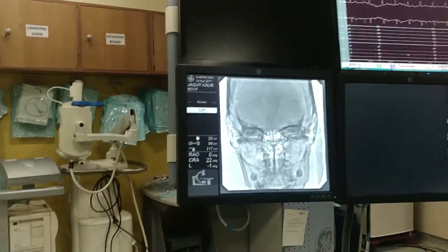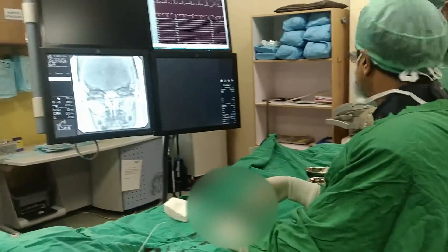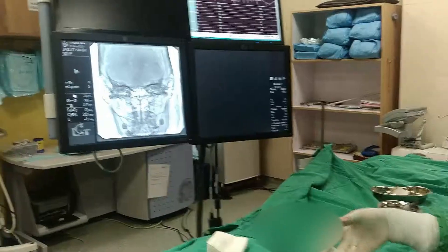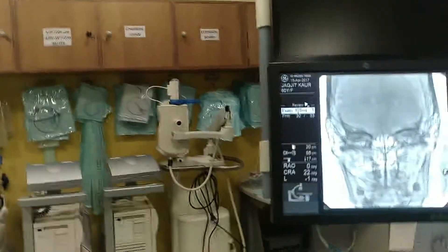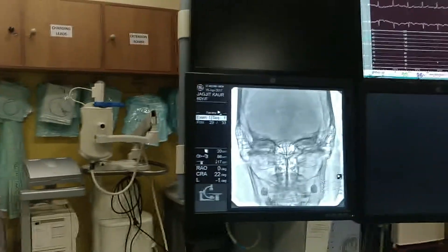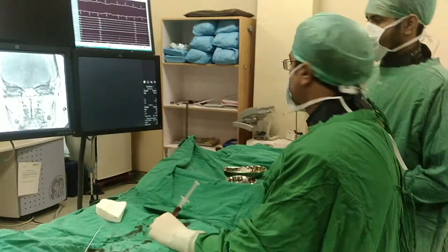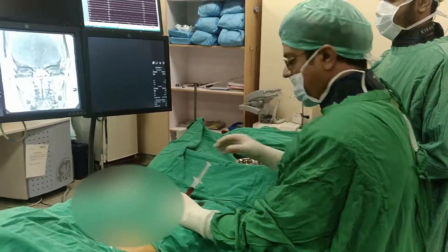Fairly well positioned. DSA 6 frames per second. OK, we could not get to Simeh so we have to re-check it — technician is on the job. 6 frames per second.